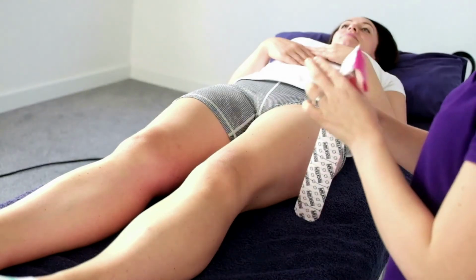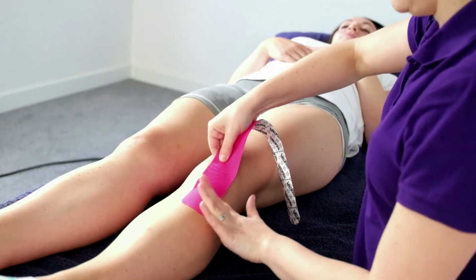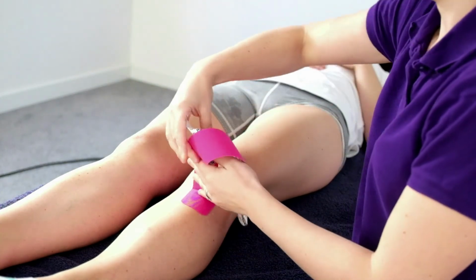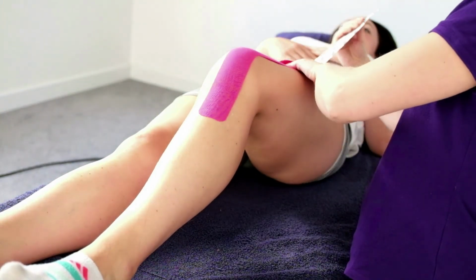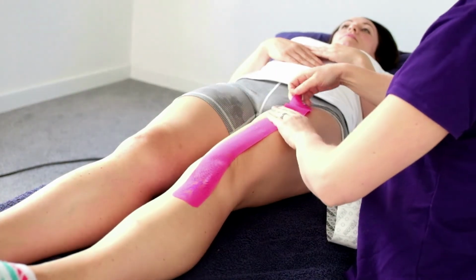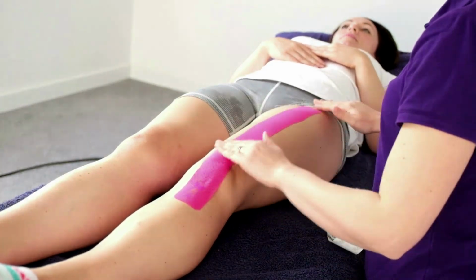We make a long anchor of the tape, applying it on the tibial tuberosity and sticking it down on a relaxed knee. We then apply a stretch onto the tissue by bending the knee, and with light tension on the tape, we apply the tape along the midpoint to the centre of the quadriceps muscle group. We then straighten the knee to attach the anchor on relaxed tissue and then stick the tape down.